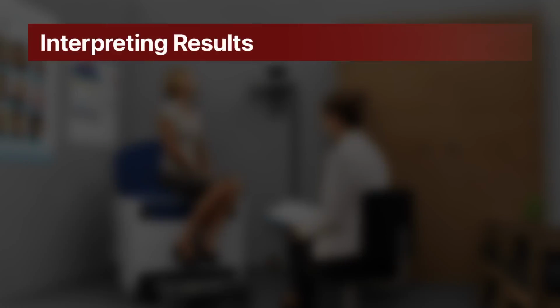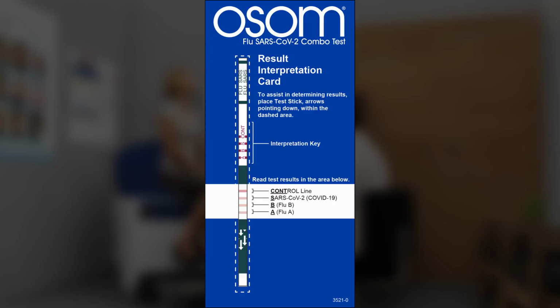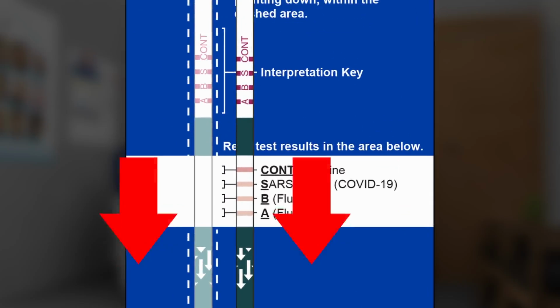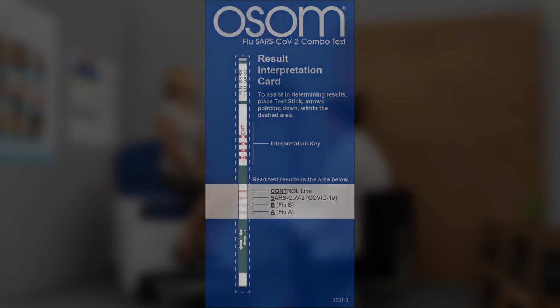Interpreting results. Place test stick, arrows pointing down, within dashed area of the result interpretation card included in the kit. Ensure arrows on the test stick are pointing in the same direction as the arrows on the result interpretation card, and that the results window is aligned. Look closely when interpreting the results.